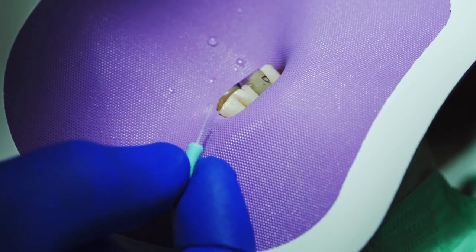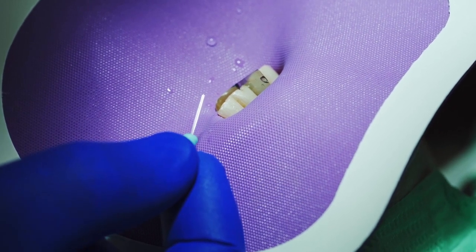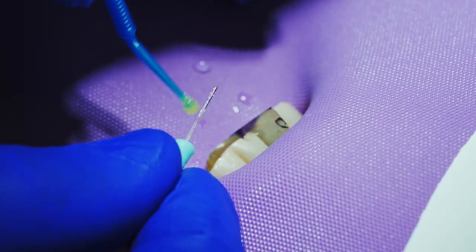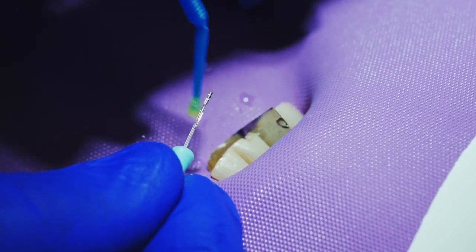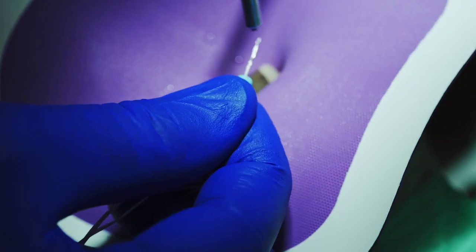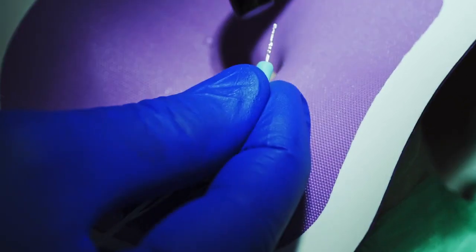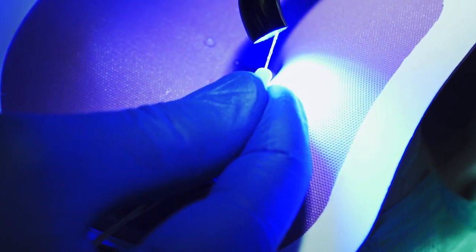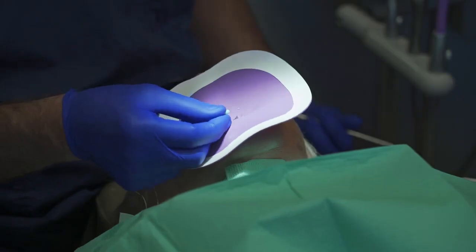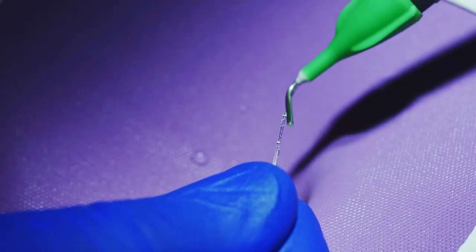The fiber is prepared and, as I stated earlier, it will accept any bonding agents or glues that you may have in your office, so we'll prime and bond. There is a handle, and we always encourage you to make sure that you have floss inserted on the handle. I like to use flowable composite to anchor it into the tooth, so I'll have my assistant put a little dot right on the tip, and then I'll insert it two millimeters into the tooth itself.